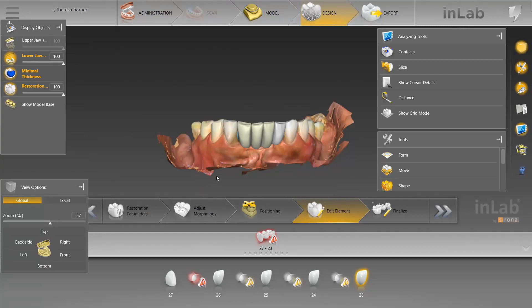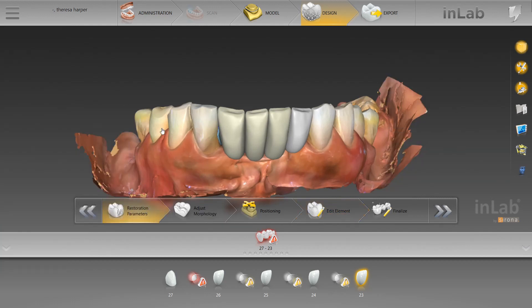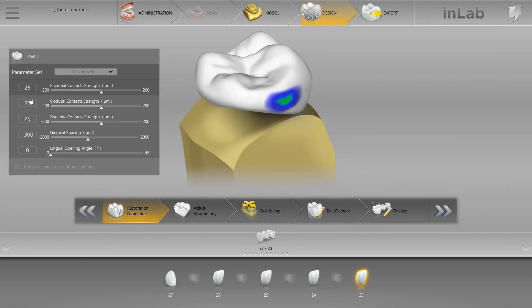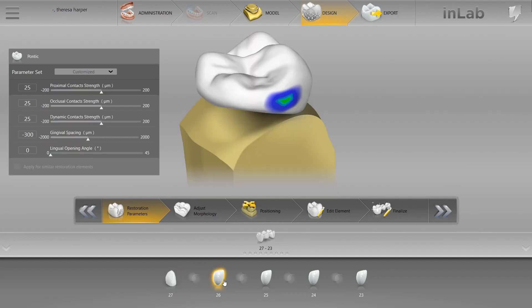Hey everyone, I see this pretty often when doing a digital diagnostic wax-up. Your case or your wax-up in the in-lab software, you've done everything that you're supposed to do. You've got all of your parameters set to zero, you've unchecked consider instrument geometry, remove undercuts, you've done all that.